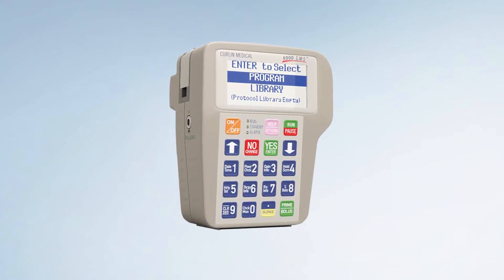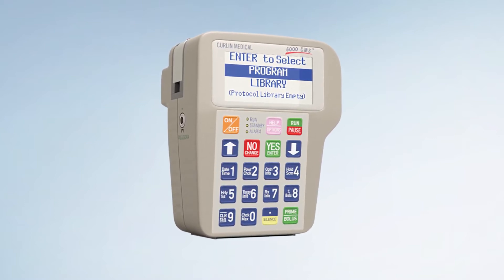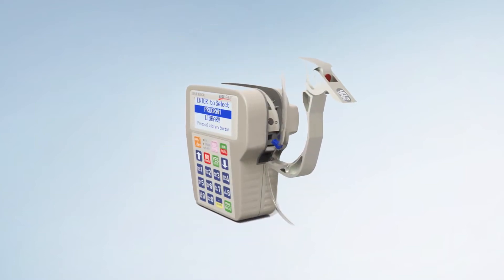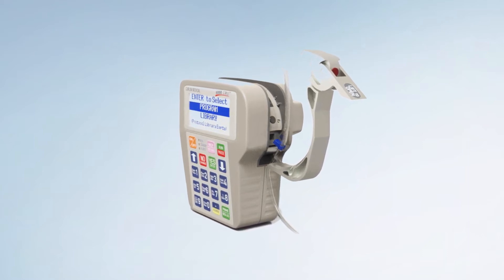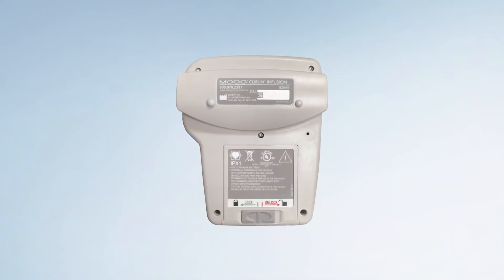Introducing the Moog Medical Devices 6000 CMS Ambulatory Infusion System. Moog Infusion Pumps are designed with the user in mind and have the latest in friendly, simple-to-learn technology to allow fast and easy access to the features of this pump. With little introduction and training, you will quickly be able to program and use this pump to deliver the infusion therapies prescribed.